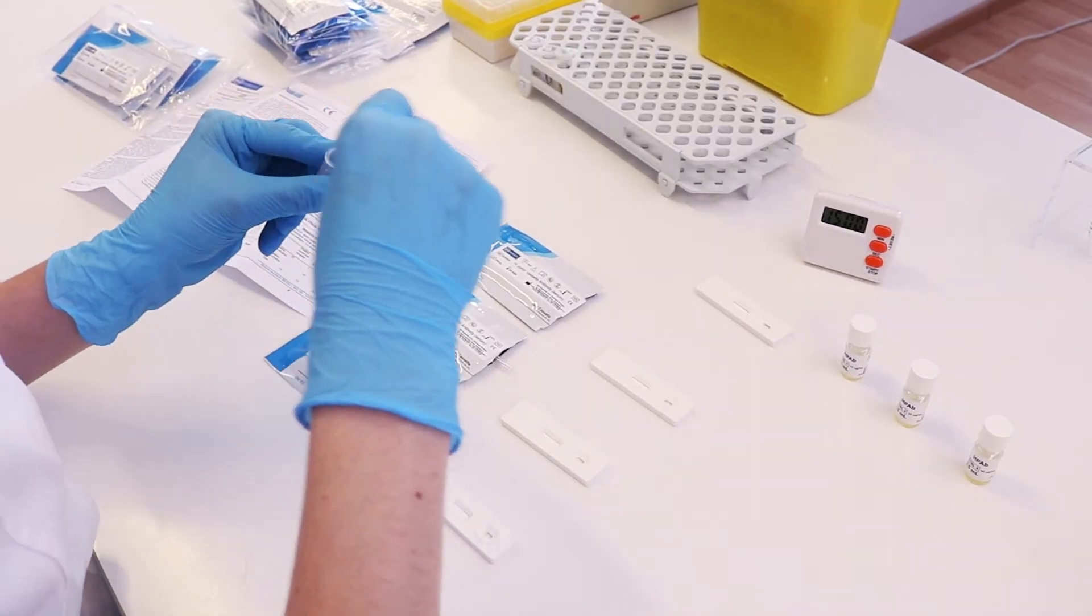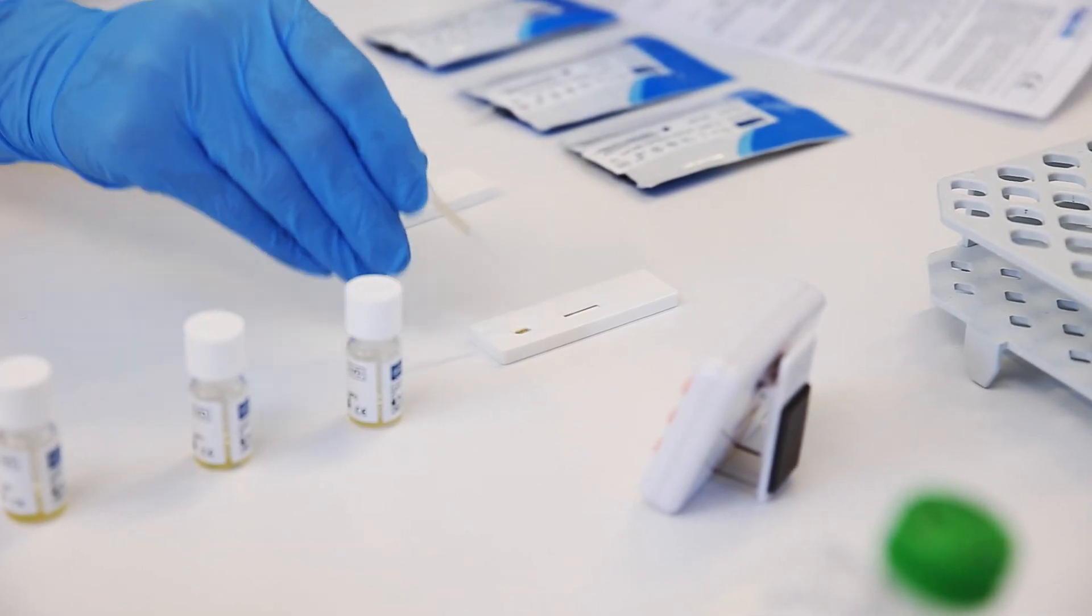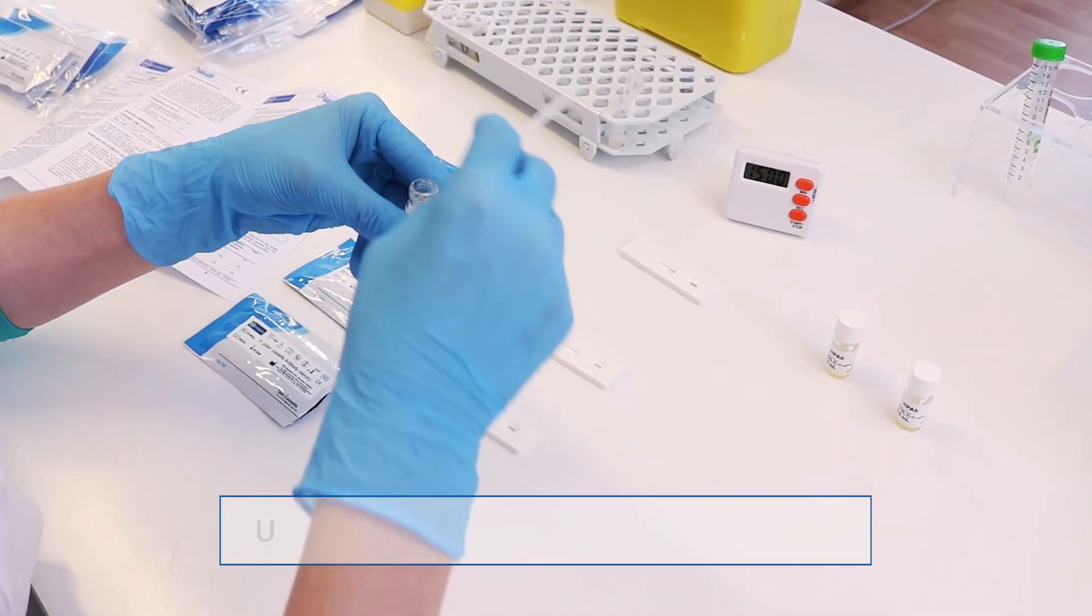With a dropping pipette, add 2 drops of negative patient serum sample into the sample well.